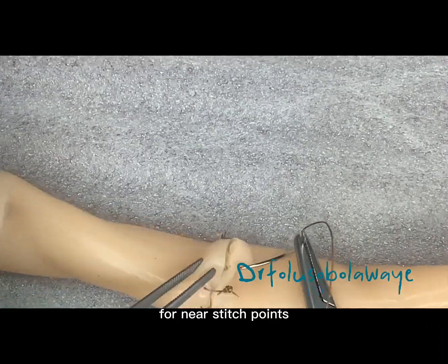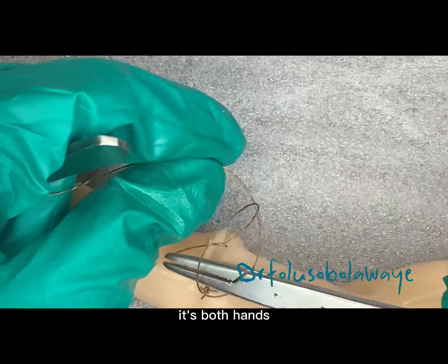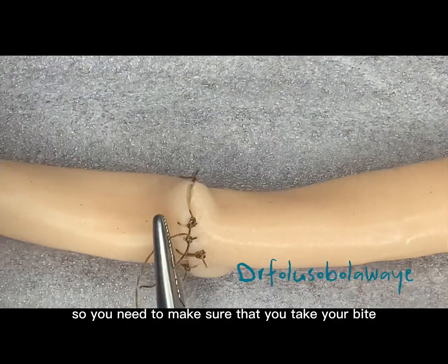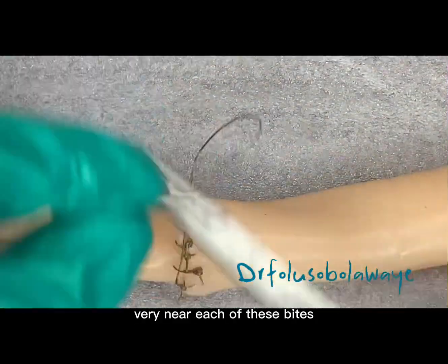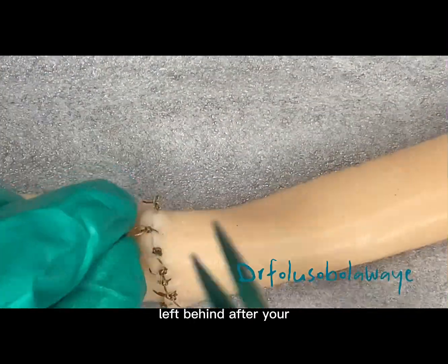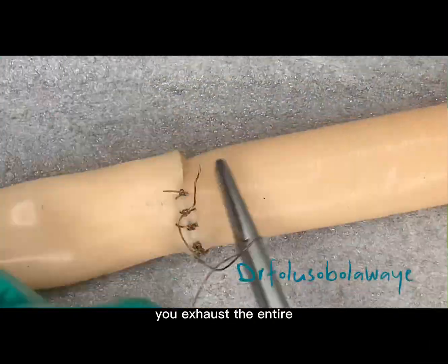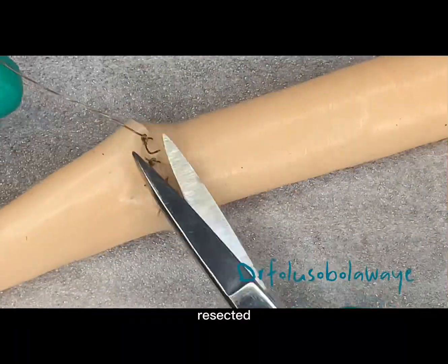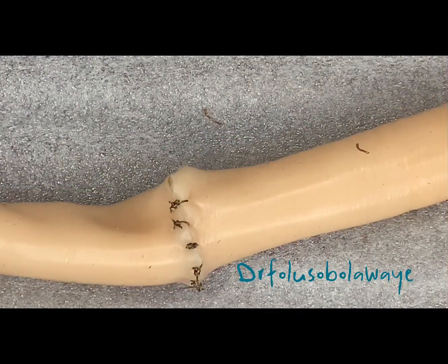This suture pattern needs sufficient mucosa thickness at the stitch points. It is done at a short distance between each stitch, so you need to make sure that you take your bites very near to each other so that you wouldn't have any leakage left behind after your suture.